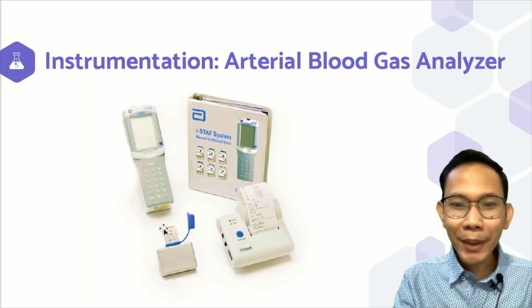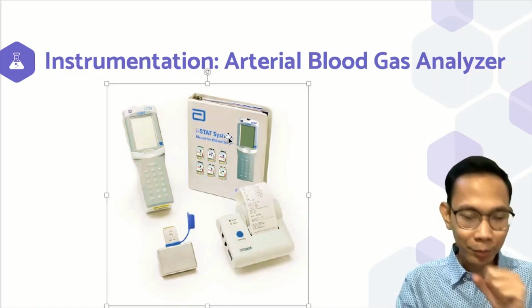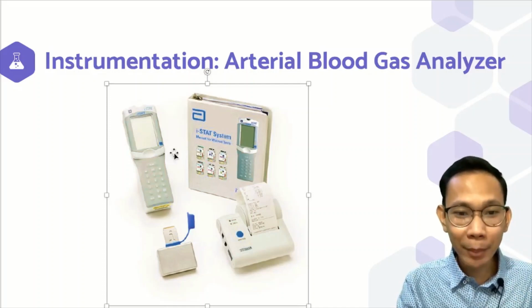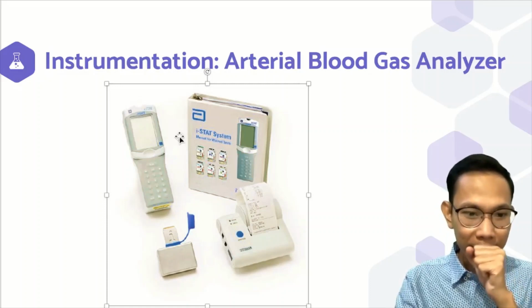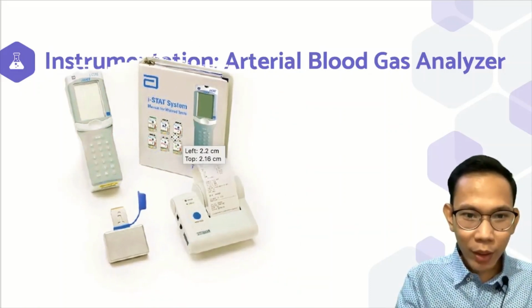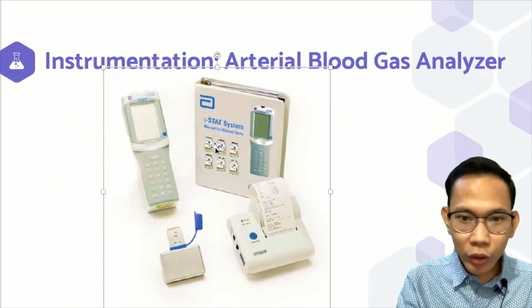So, ito yung ginagamit namin sa aming hospital, di ba? Ito yun, yung nagra-rounds kami. Yung binibigay na yung sample ng ABG namin. Dito namin tinitest yung sample. So, again, anong ginagawa namin dito? Meron siyang cartridge. Ito yun, oh. Parang ganito siya size, tapos ipapasok mo lang dito.